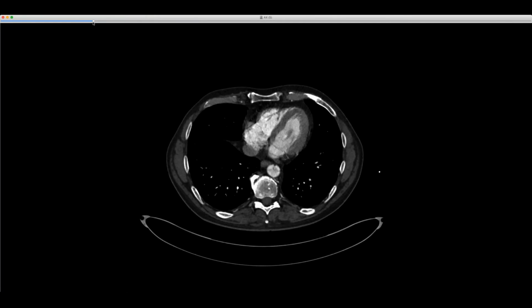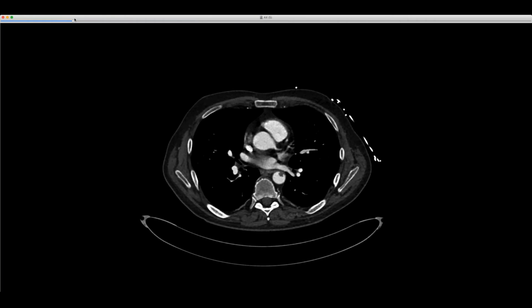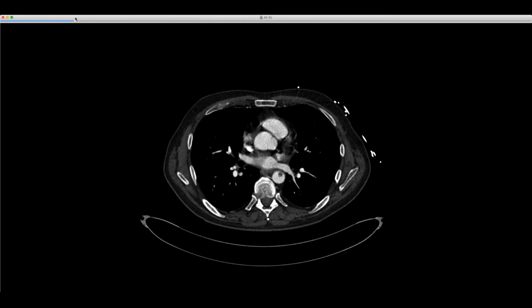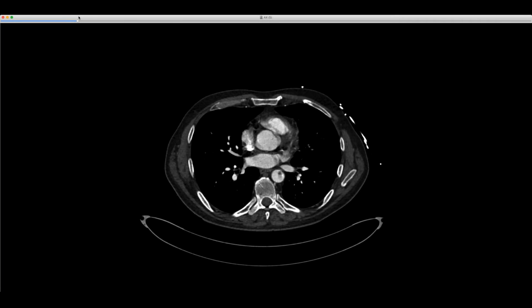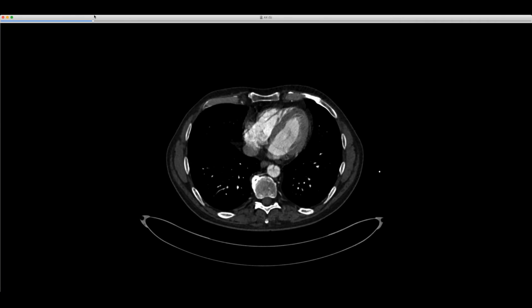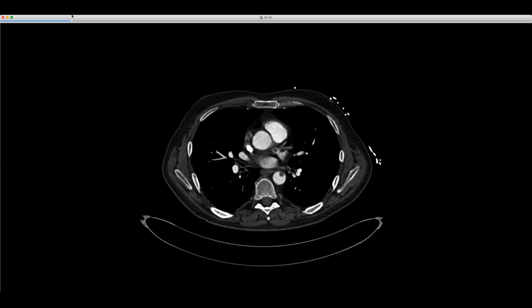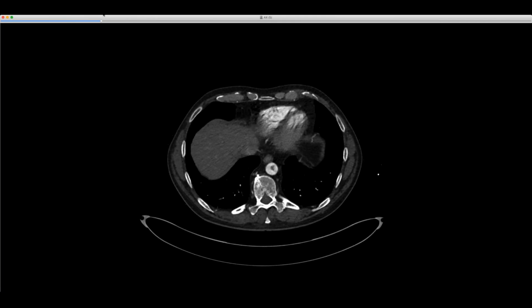So this is an interesting one. Look at the free-floating aortic thrombus here in the descending aorta, just kind of hanging out. This was originally seen on a partial CT, an abdominal CT. The thought was, could this be a dissection, because they didn't have a full view of this? It's obviously not. It's a free-floating adherent thrombus. It's adherent right there, and it goes down there.